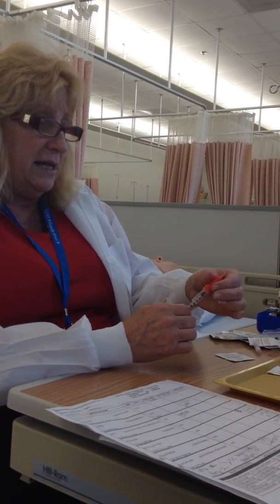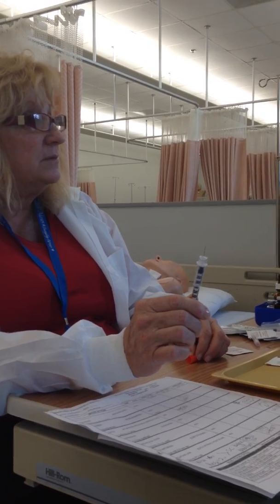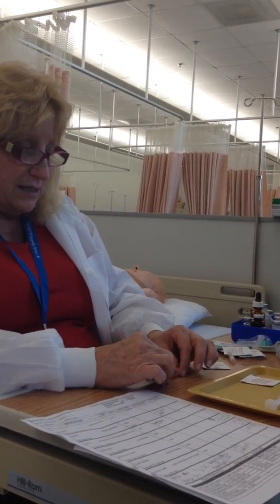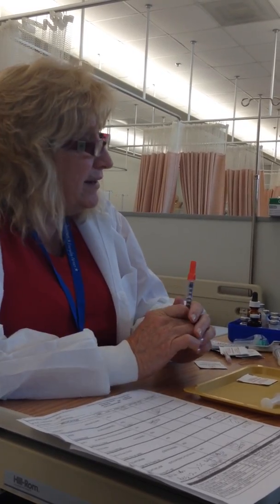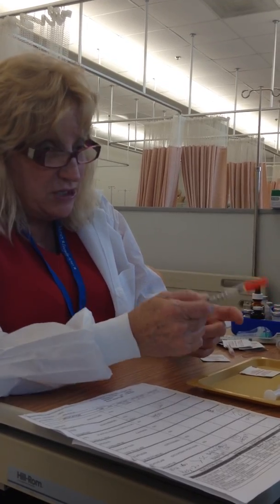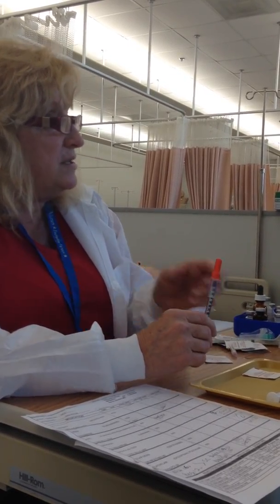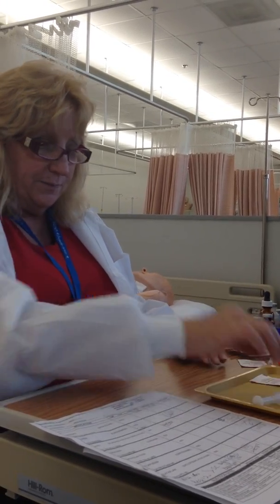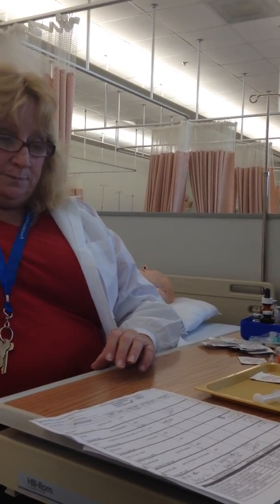So Z-Track's the only one that you put the little pocket of air? Yes. And you can change needles anytime you want to, except the insulin is a permanent needle. You can't change it. But with the Z-Track, you always want to change the needle? Always, because the medication is very caustic and rarely given, and it's on the very outside of the needle. It's a technique of sealing the medication in the muscle, and you're always using the ventral gluteal site. Okay, so here we come.